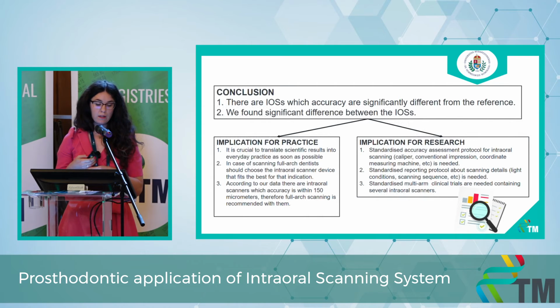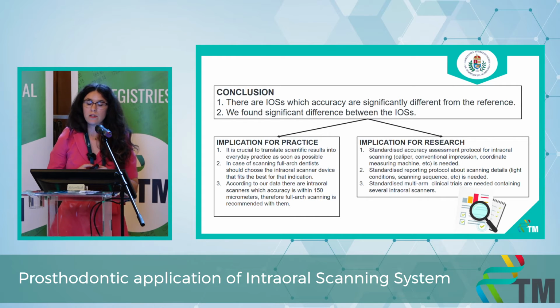As for conclusion, we rejected our hypothesis, as we found significant differences between the intraoral scanners and also significant differences from the reference itself. And as for the implication for practice, it is a very important topic because all dentists should choose the right scanner for what they use it for.